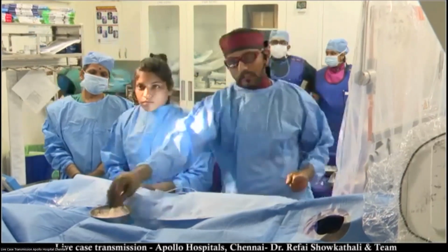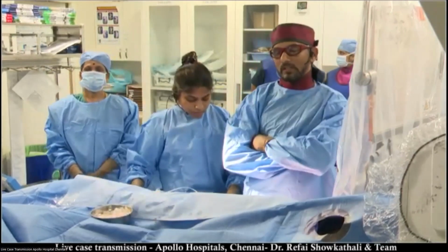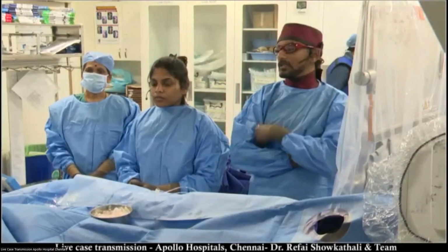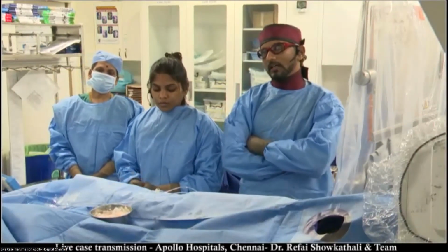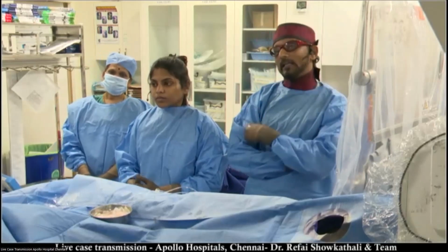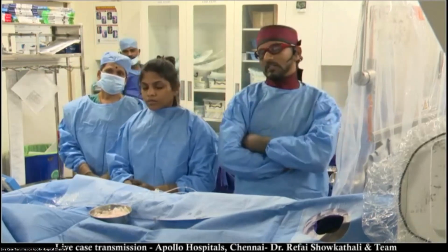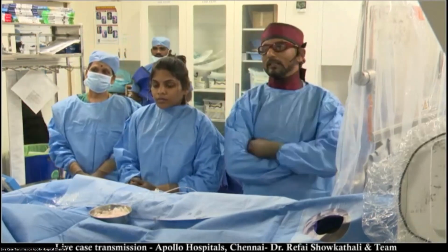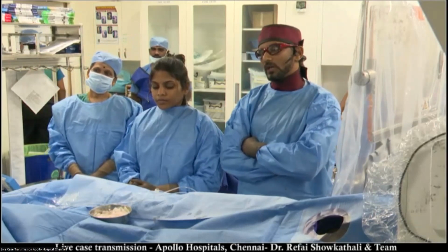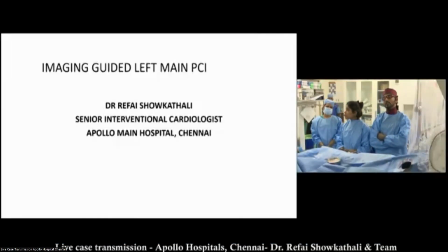Sure. Thank you. Thanks to the organizers, particularly Dr. Srinivas Kumar, for giving this opportunity to present our case. Before we start, I'll introduce my team. I have Dr. Radha, my associate junior consultant, and Mail and Bala as our technicians, Ramus as our scrub nurse, runner nurses Pragati and Gopi, and the Abbott OCT team with us as well. Let Dr. Radha talk about our case to start with.